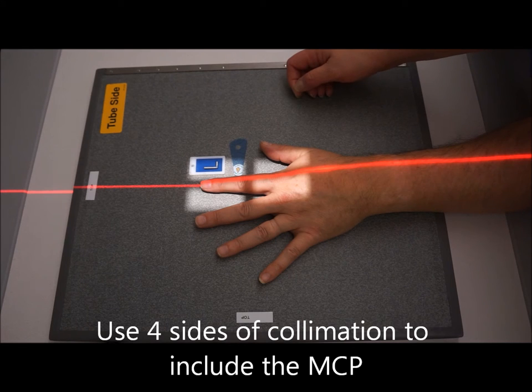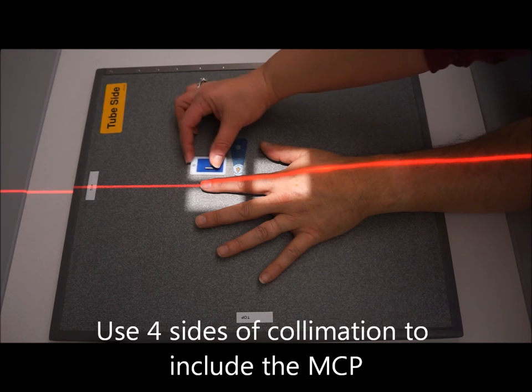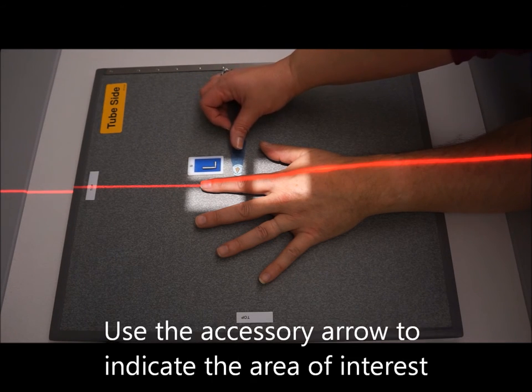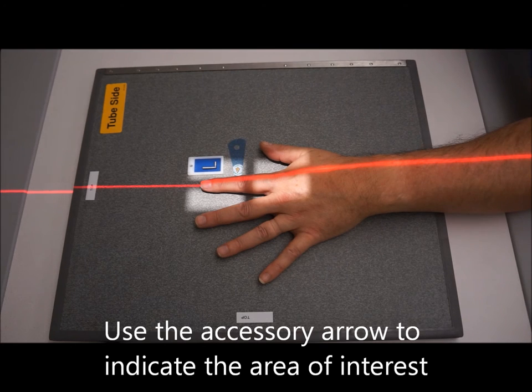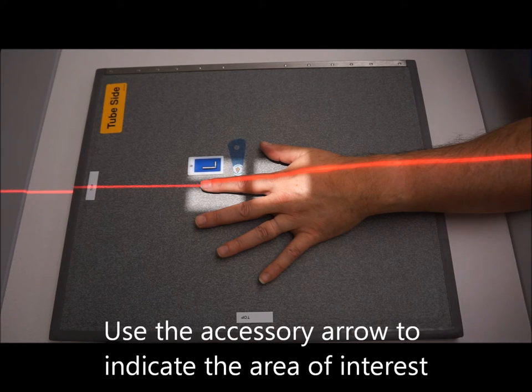We want to make sure that we've got the entire digit distally. I want to make sure that I have the marker here, and then our accessory marker pointing to the area of interest.